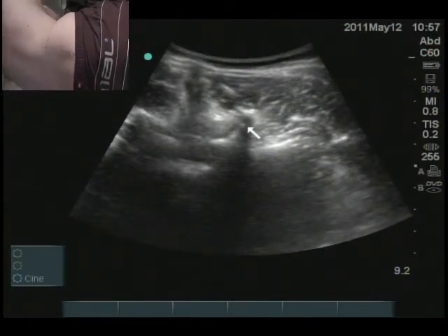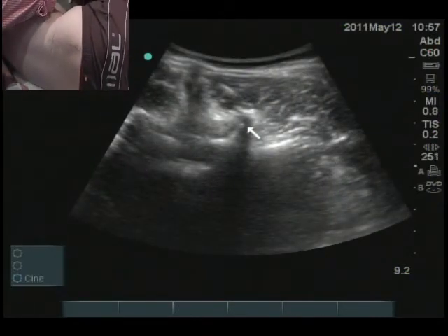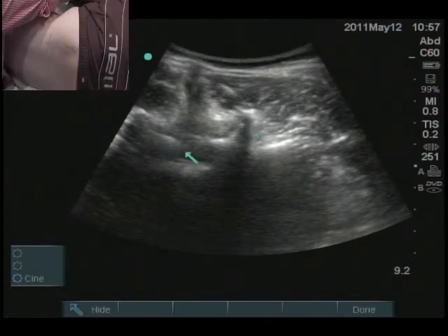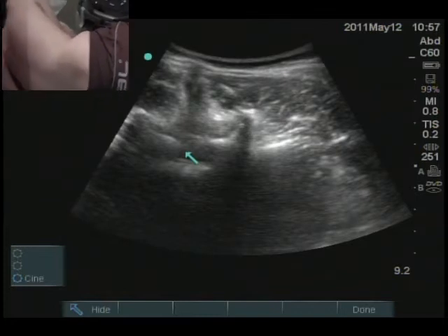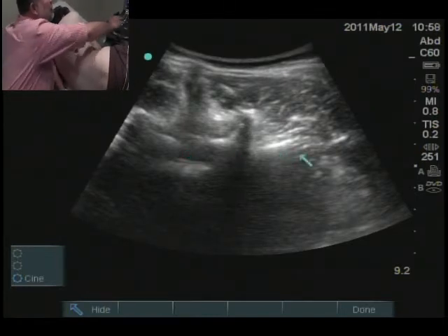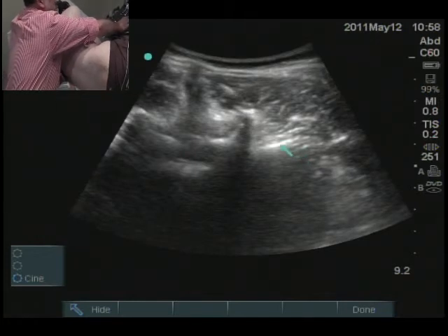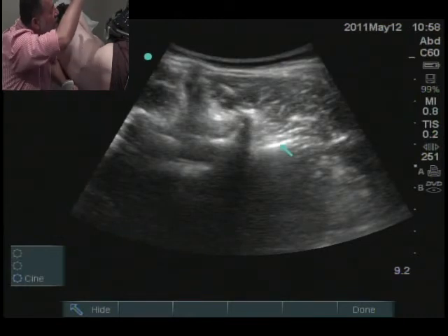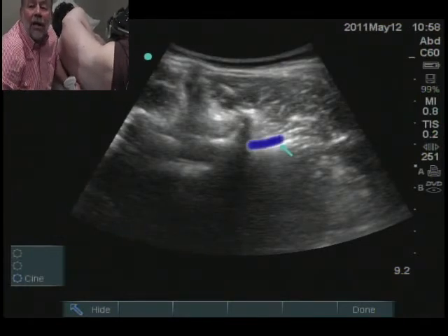now you've got a different picture, okay? What I want you to do is not look at the bit that you want to see, which is, you're all now looking at that bit there, aren't you? Because that shows you the spine and the dura. But I'm not interested in that. What I'm interested in is that line there. Now that line there is dropping a black shadow beneath it.